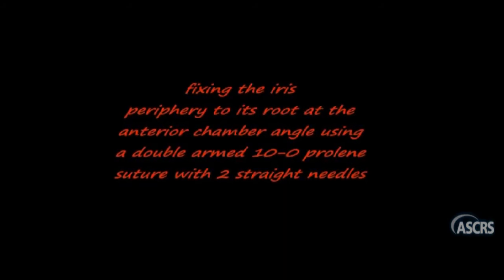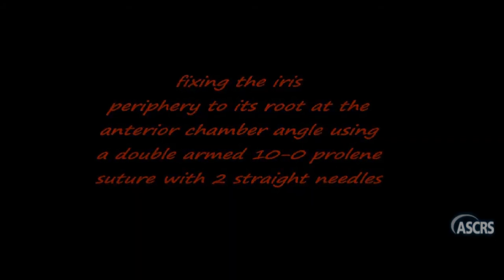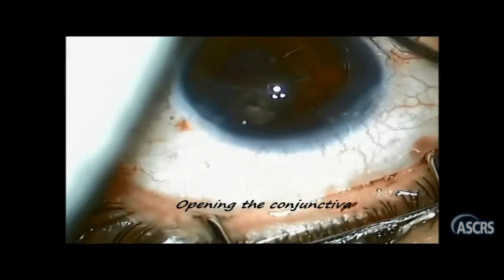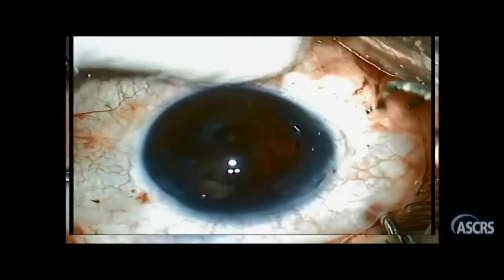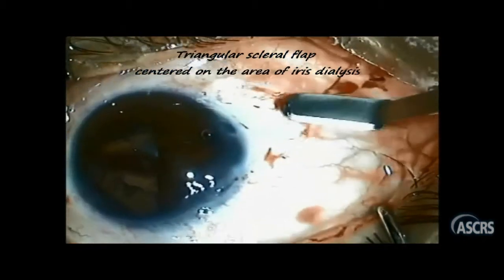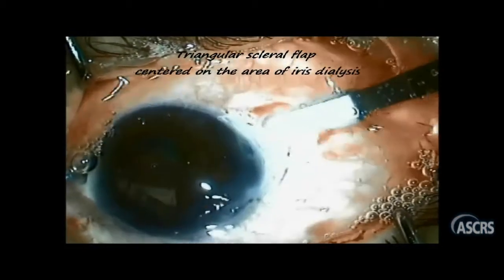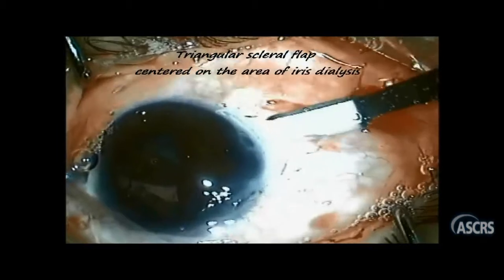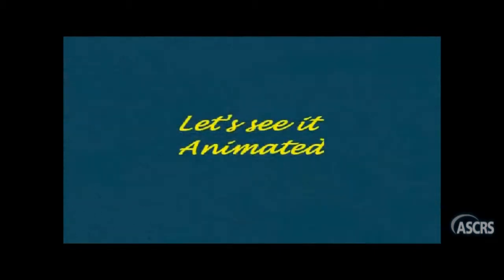And that's when it hit me. What about trying to fix the iris periphery back to its root, using a double-armed 10-0 prolene suture with two straight needles? Before showing you the real video, I'd like to show you an animation describing the idea.